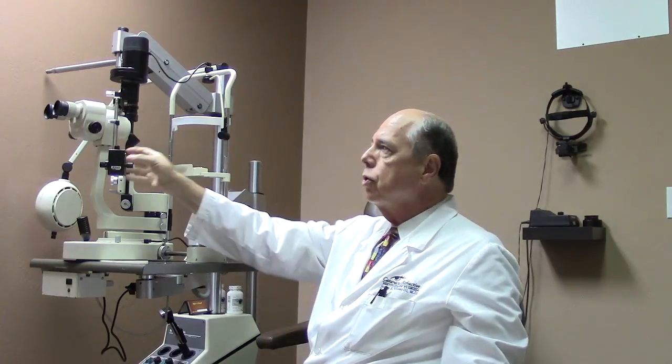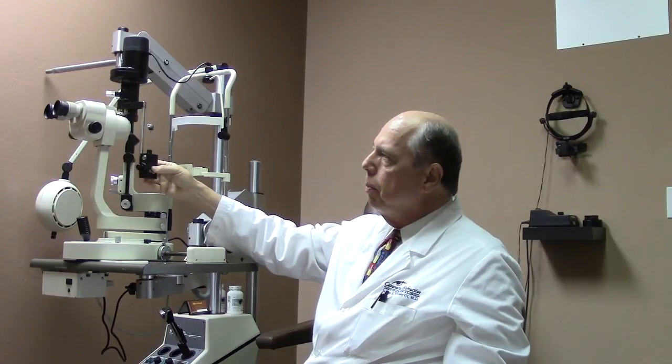Another thing we do is that attached to the slit lamp is a tonometer — this is a Goldmann tonometer. This tonometer is used to check your eye pressure for glaucoma, and it's attached directly to the slit lamp.